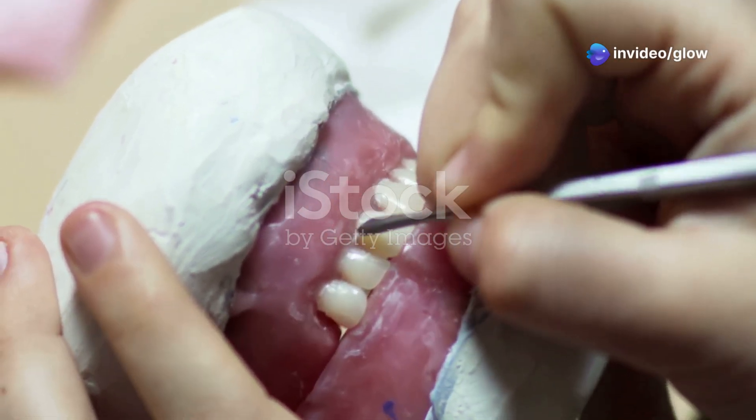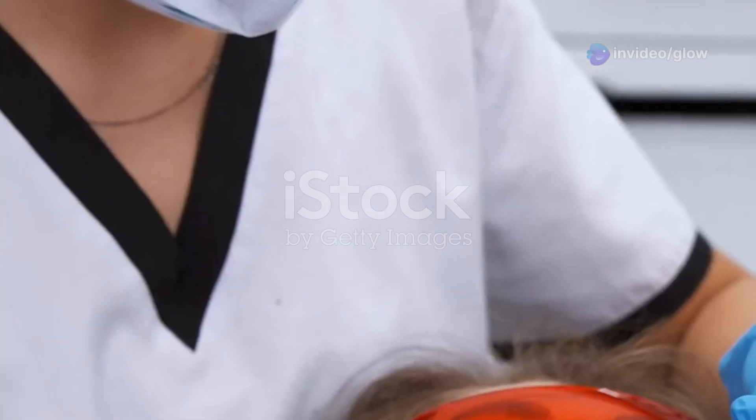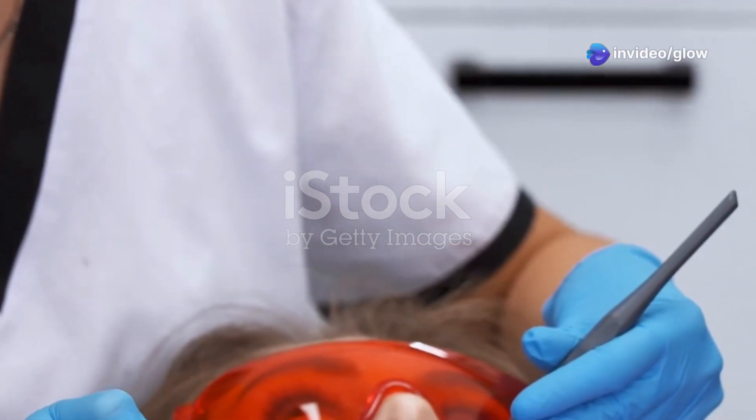All right, dental students, let's talk about the bread and butter of restorative dentistry: cavity preparation. This is where a tooth gets its makeover, transforming from damaged to functional, and I'm here to spill the secrets to perfect fillings. Ready? Let's dive in.